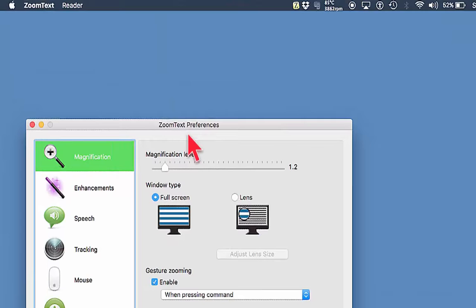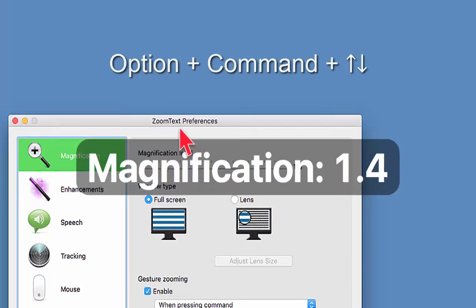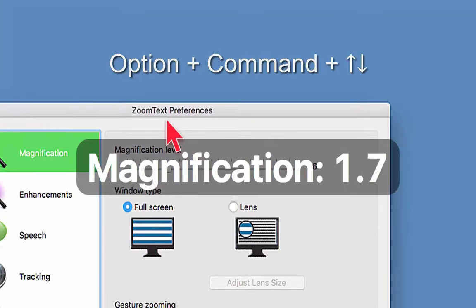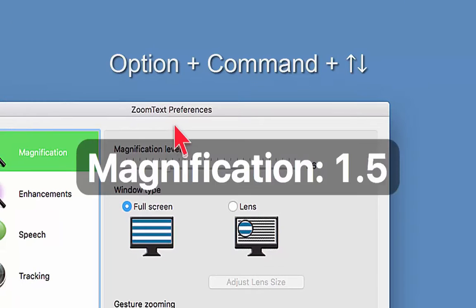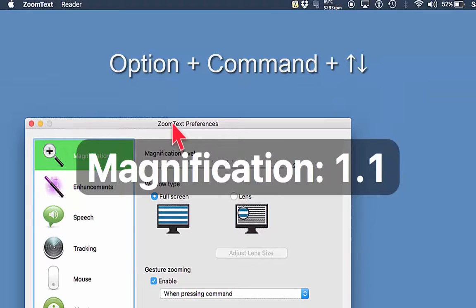If I want to zoom in, I use the same shortcut — Options + Command — but this time with the up and down arrows. As I press up you can see it expanding, and if I go down it will then decrease.